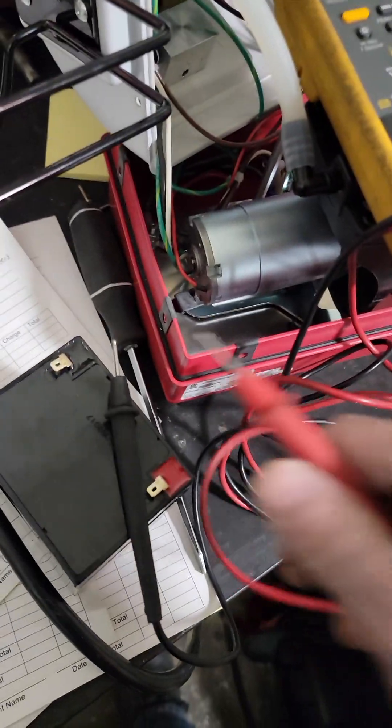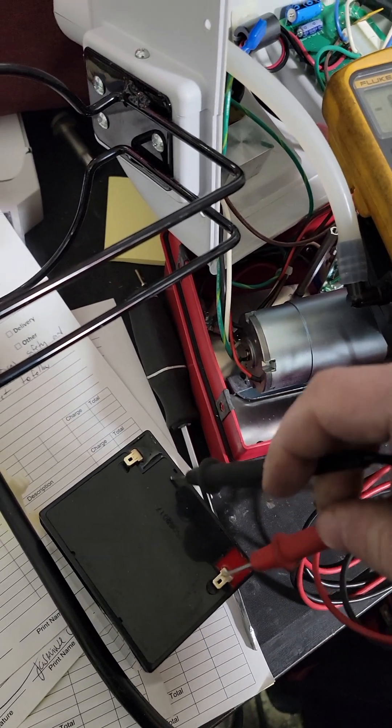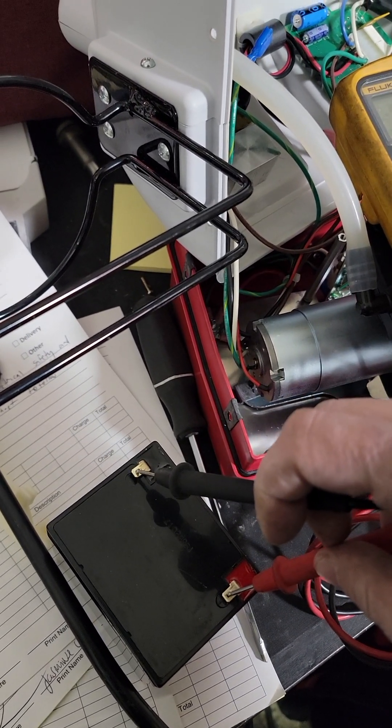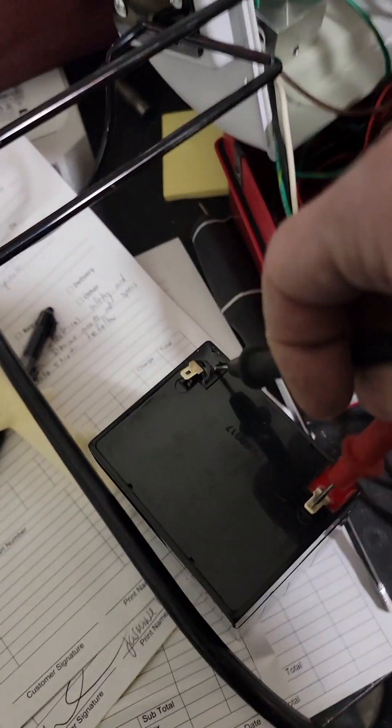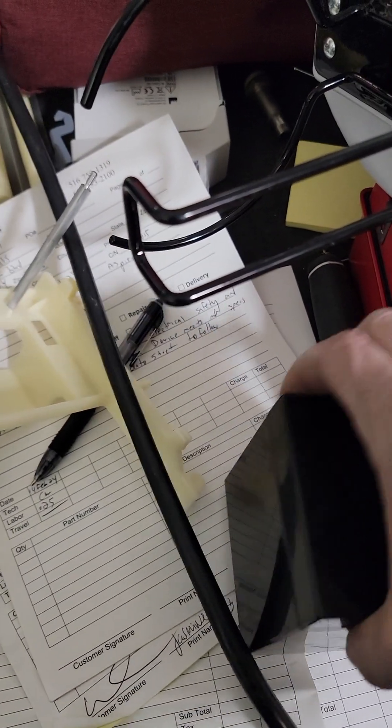That's what we got here — black and red. Reading 1.9 volts when 12.7 was the minimum? Yeah, that thing's dead.